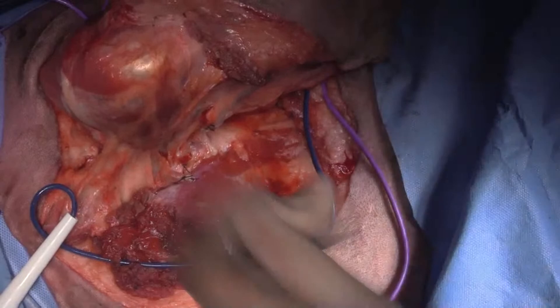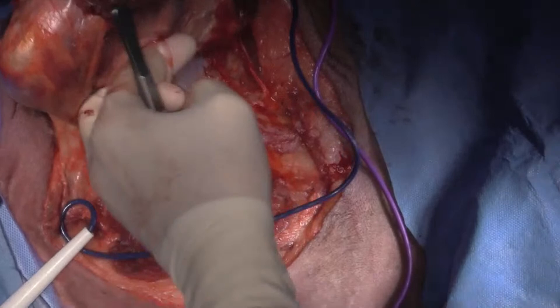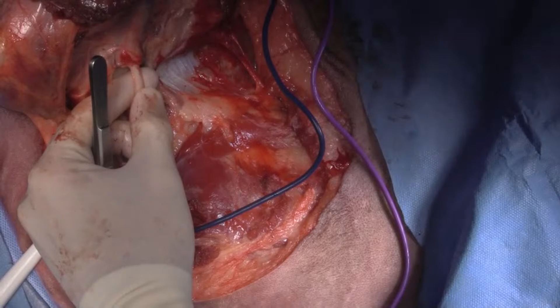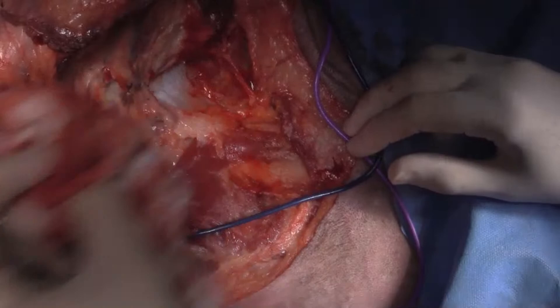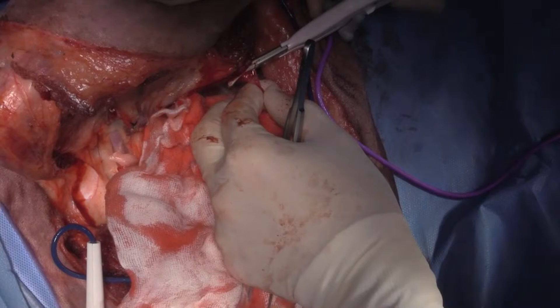We've got a couple of big nerves in here. There's a little bit of bleeding back here still, coming out of the muscle belly.